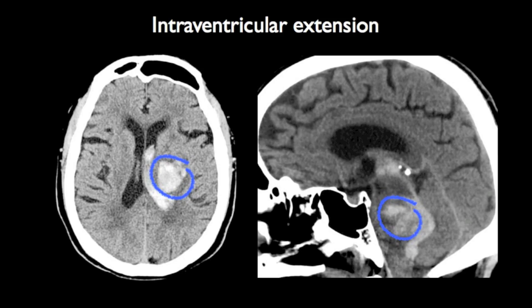The location of hypertensive hemorrhages deep within the brain and usually adjacent to the ventricles makes them prone to extend into the ventricular system. On the first image we can see a left-sided basal ganglia hemorrhage extending into the left lateral ventricle. On the second image, a pontine hemorrhage extends posteriorly into the fourth ventricle and extends superiorly through the aqueduct of Silvius and into the third ventricle.